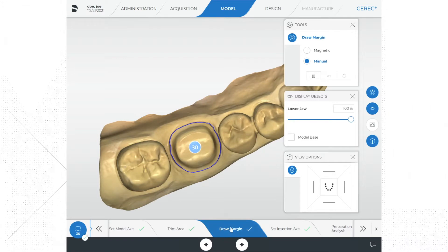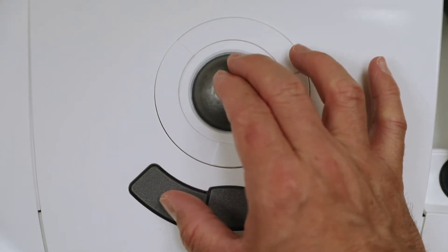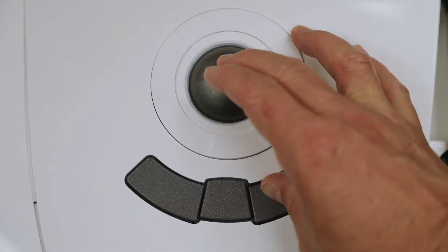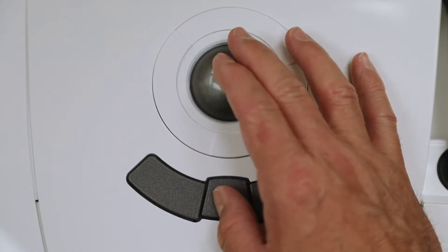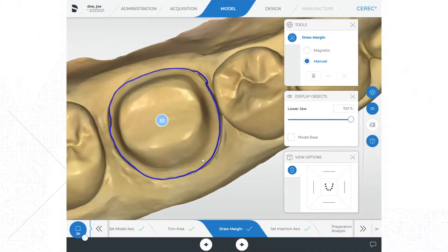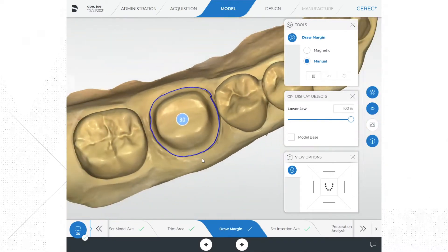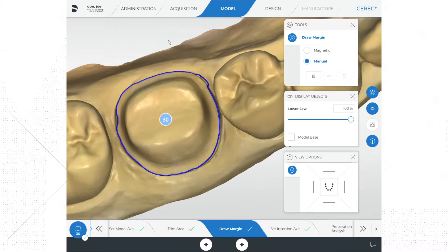Go ahead and click on the draw margin icon at the bottom of the screen in the step bar. Before we work with the margin, I want to show you another feature of the trackball mouse. If you left-click you will be able to rotate the model around an axis. If you right-click you will be able to move the entire model around the screen. If you click the middle button and rotate the trackball you will be able to zoom in closer to or zoom out away from the model. When drawing the margin I like to zoom in a little closer to the prep so I can better visualize the model.